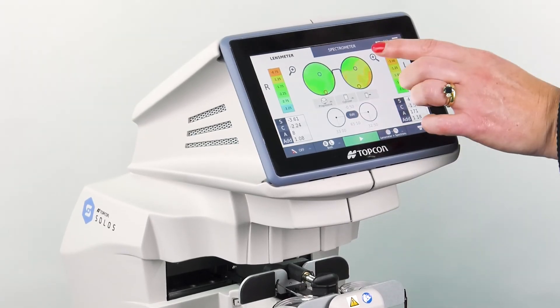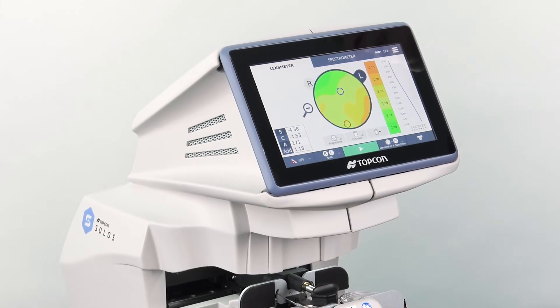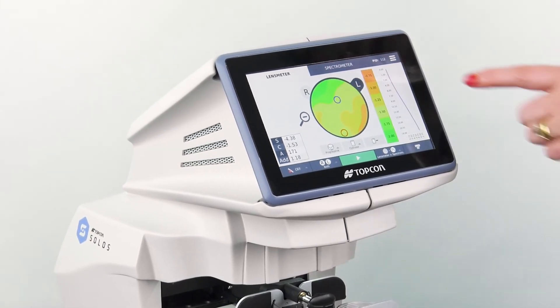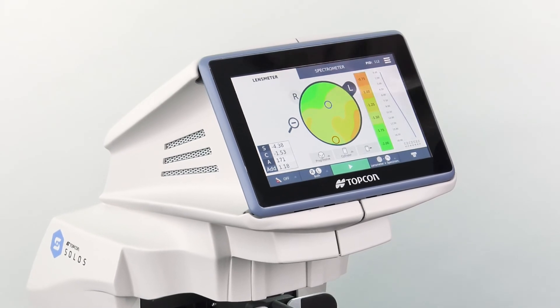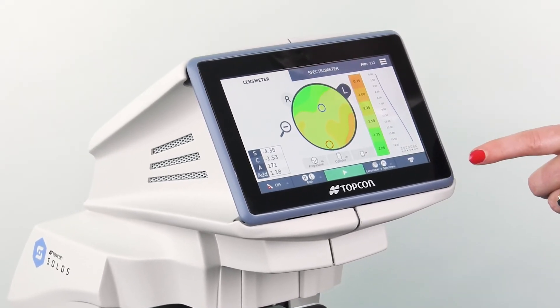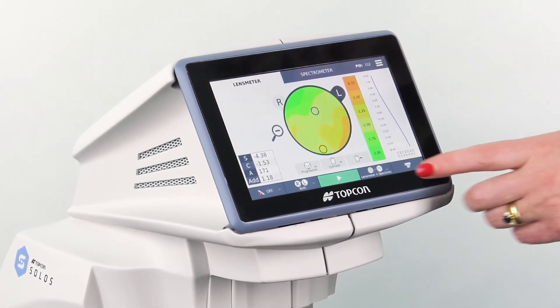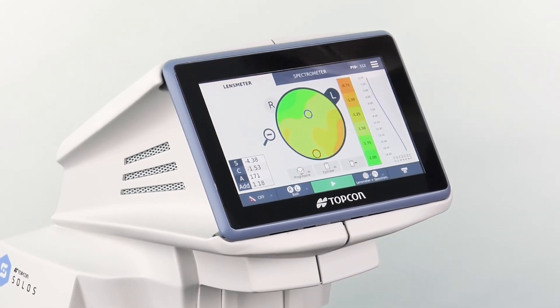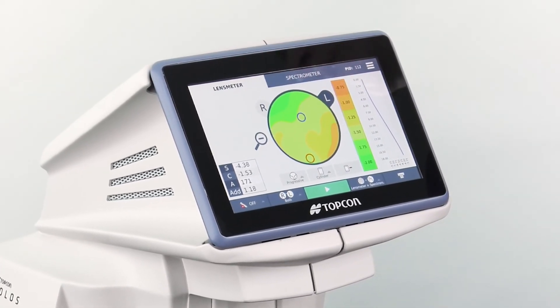I can zoom in and look at a lens in more detail. It shows the information down the side — the lens power profile from distance to near, and in this case the power ranges from minus 5.25 to minus 3.75 at the bottom.